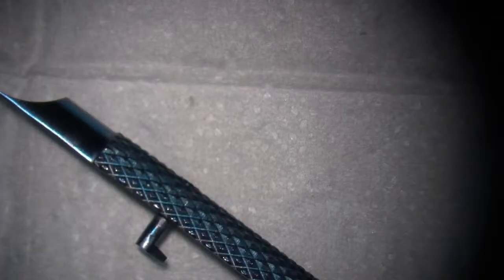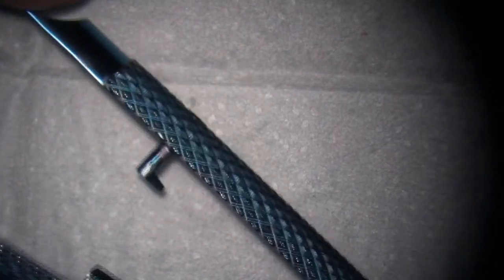Yeah, see that? That's a hook. When we reach the hook, it locks. When we press it again, it goes beyond the hook. Are these the most commonly used in the operating room then, with the locking mechanism, or depends? Depends. You will try and then you will understand better. The locking instrument, the problem is once it locks, you have to unlock it. It's not so free. Like this one is just free. You can put down a needle, pick up a needle very quickly. But with the locking instrument, sometimes you pick up a needle and then you can put it there, and the needle won't go away like with the regular instrument.